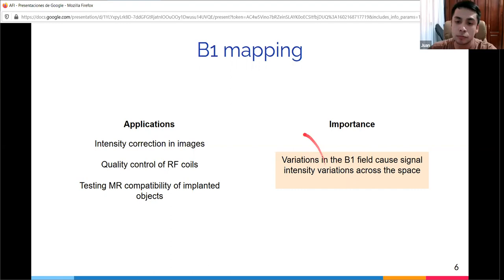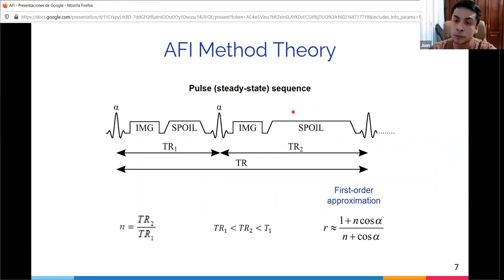Non-uniformities of the B1 field introduce or are caused by variations in the B1 field and cause signal intensity variations across space. Uncorrected variations in signal intensity also lead to variation in quantitative metrics. This is one potential reason to perform B1 mapping. There are several methods proposed for B1 mapping, and here they focus on actual flip angle imaging.